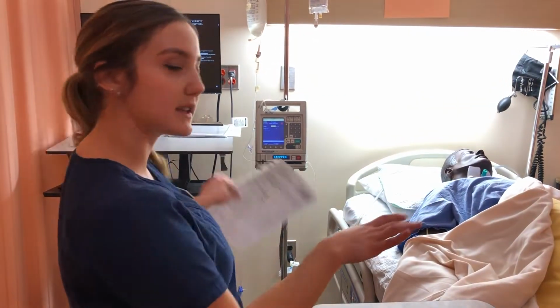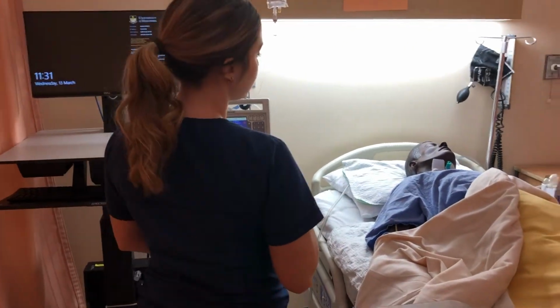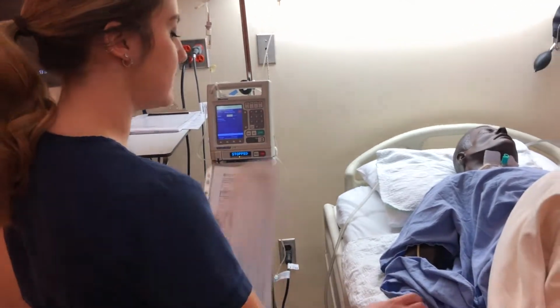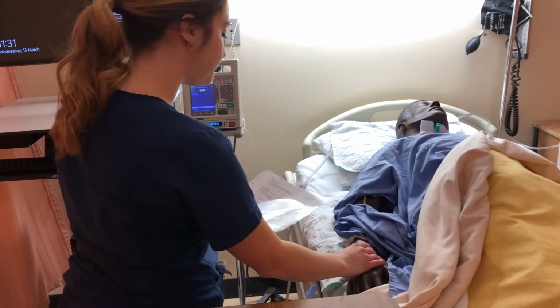I've done just a general safety check. I'm going to introduce myself. So hi, my name is Tesslah. I'm going to be your student nurse today. I'm going to be administering your heparin infusion. I'm just going to take a look at your wristband, okay?